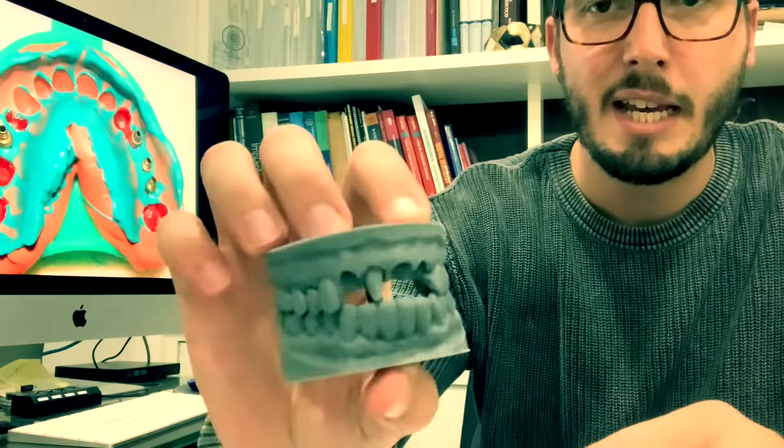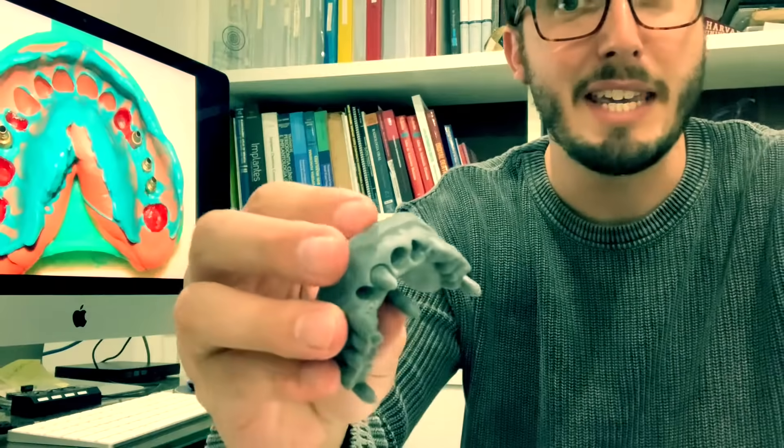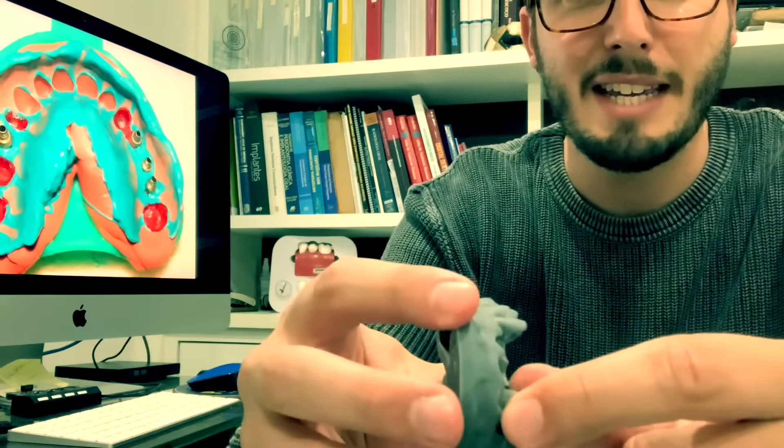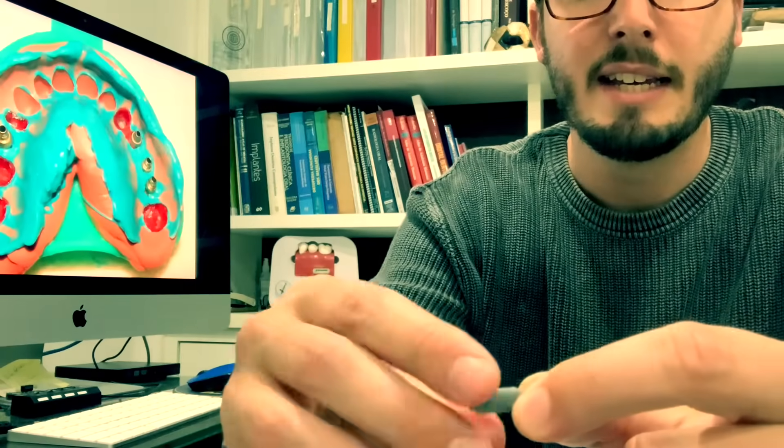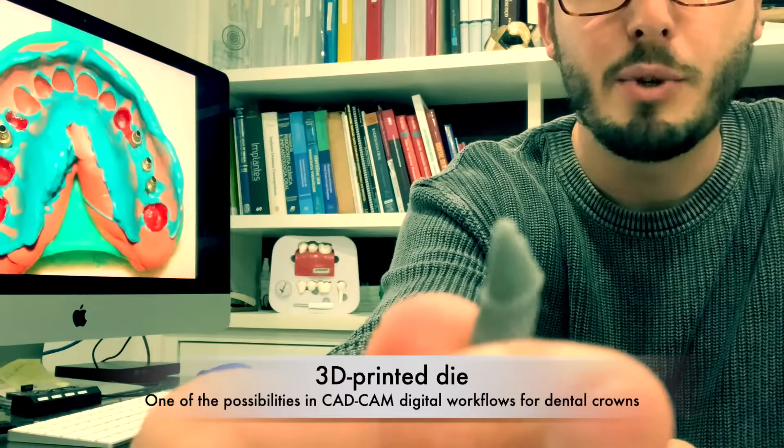And we have even a 3D printed die here. So that's the die. I'm going to remove the die, the 3D printed die, and you can even try your crown on the 3D printed dies in order to adjust interproximal surfaces for example of your crown.